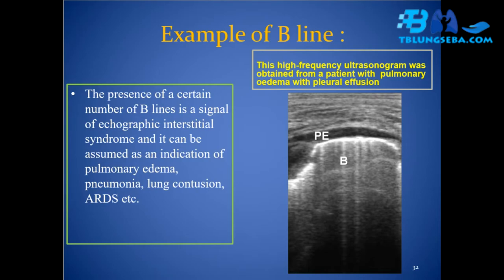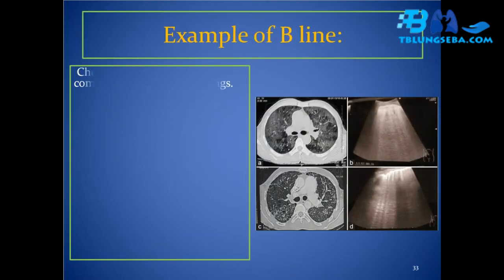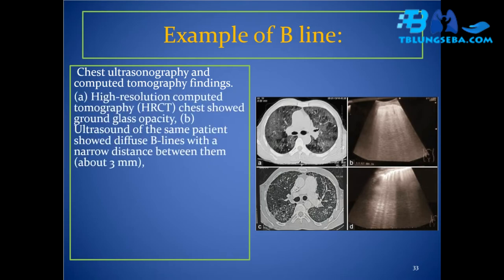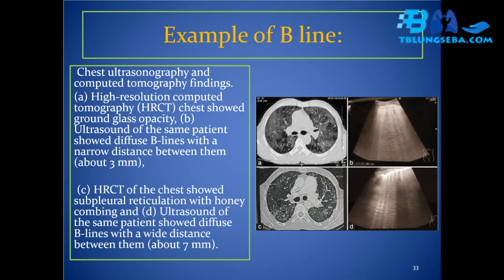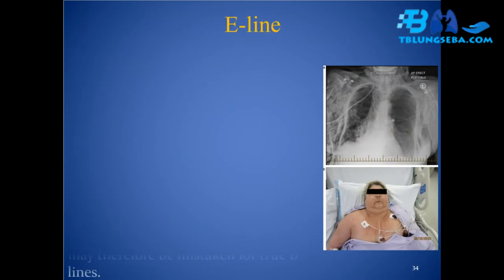Example of B-line: this high-frequency ultrasonogram was obtained from a patient with pulmonary edema with pleural effusion. Chest ultrasonography and CT findings: (A) HRCT chest showed ground glass opacity; (B) ultrasound of the same patient showed diffuse B-lines with a narrow distance between them (about 3 mm). (C) HRCT chest showed subpleural reticulation with honeycombing; (D) ultrasound of the same patient showed diffuse B-lines with a wide distance between them (about 7 mm).